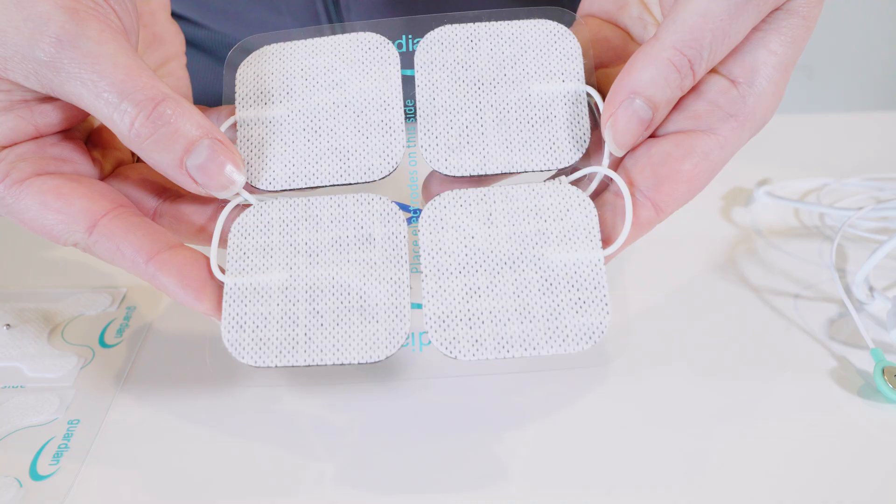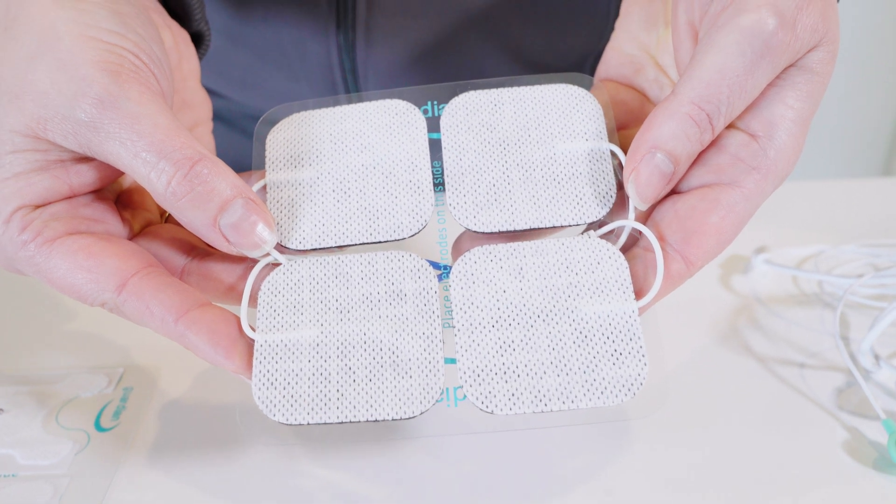If you're using the Guardian Aspire 2 swallow stem, you'll want to make sure that you get the 2x2 reference electrodes to use for your surface EMG readings.